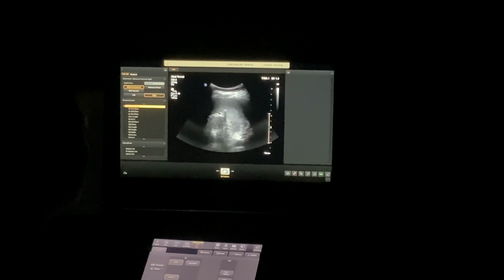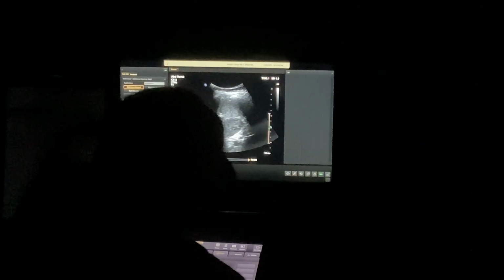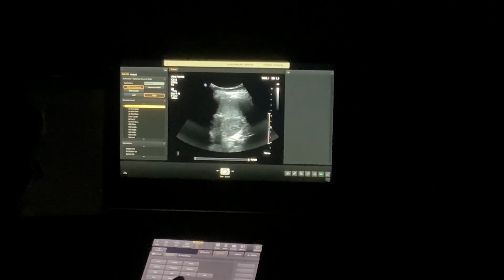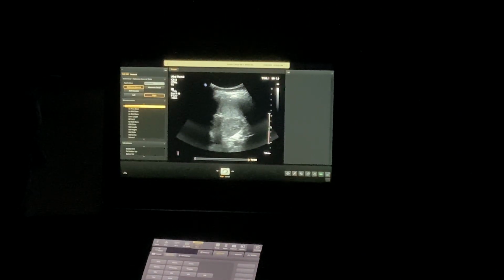So for the left, your spleen is your window. Same thing I did with the liver. I'm going to start a little higher up and angle down through it. Breathe. That's superior trans left kidney. If I have to go way back here to get it, you're not going to have any spleen in your picture, so you won't be able to use that as a window if their kidney sits way further back. Which is why when you roll them, now you've created a window for yourself. Deep breath.